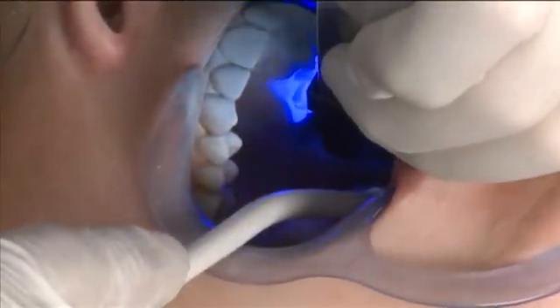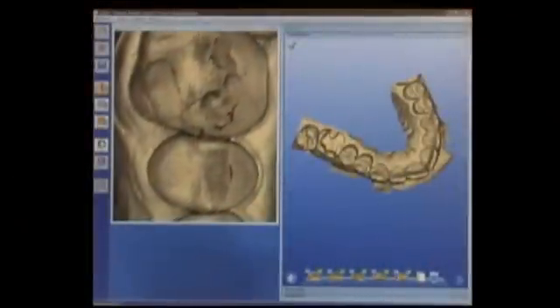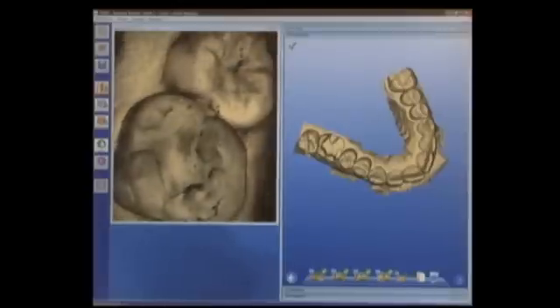This is where things get really exciting. Let's imagine for a moment all the things we'd like to be able to do with the digital impressioning system. Well, now with BlueCam, because we can capture a full arch, these things are possible. We can create a physical model and we can collaborate with a laboratory via CEREC Connect, not only for single teeth, but for multiple restorations as well.